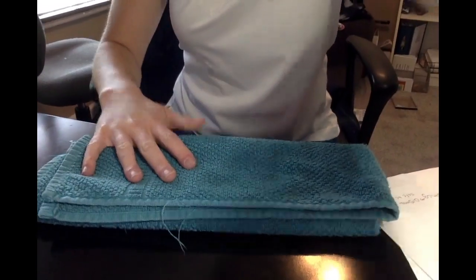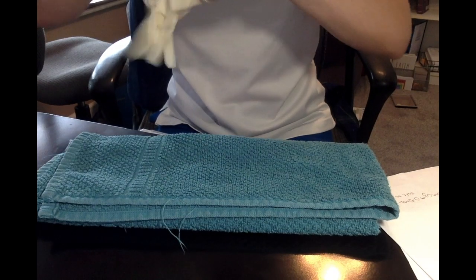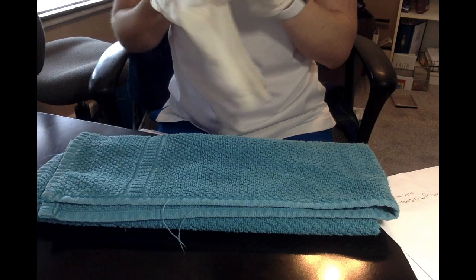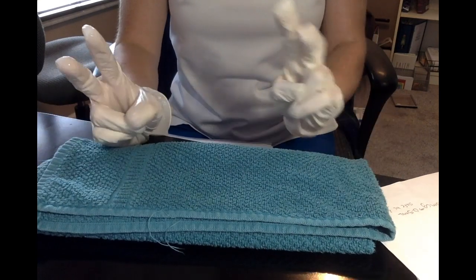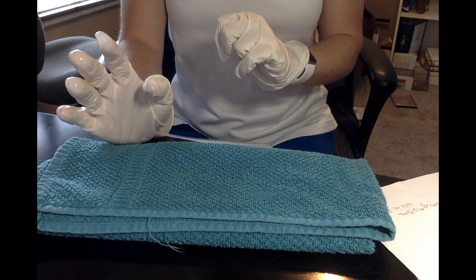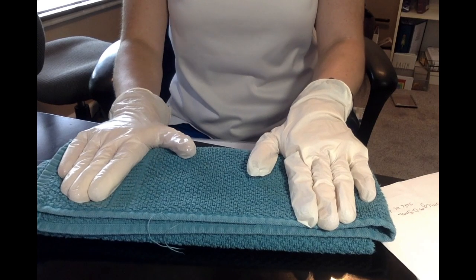And then I would wash my hands, and I would put on my gloves. And then I'm going to be using the outer posterior aspect of the upper arm. And we're going to do the pinch method, so it depends on how much skin you can grab.